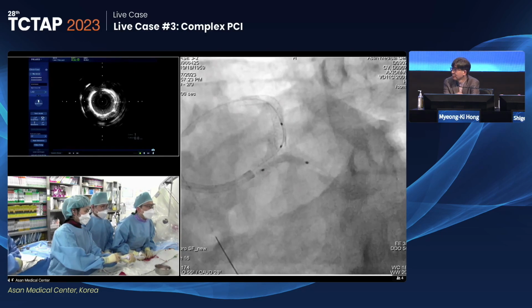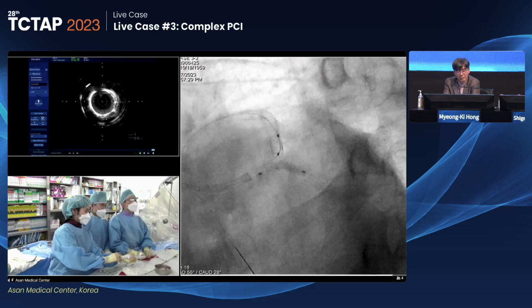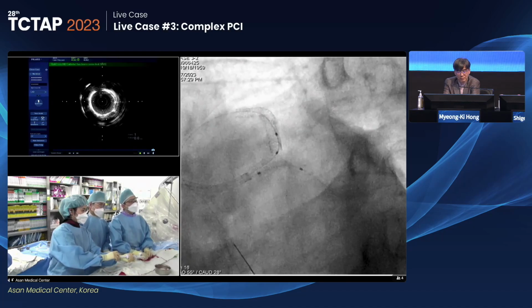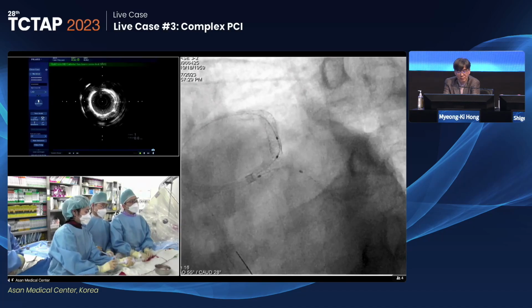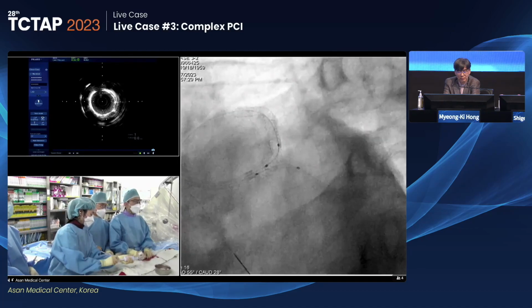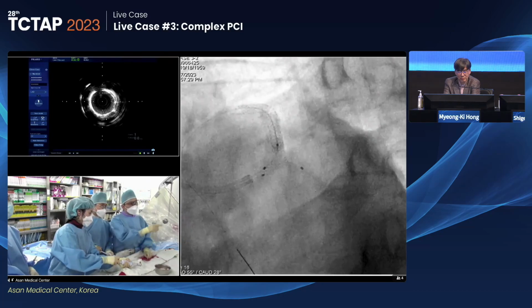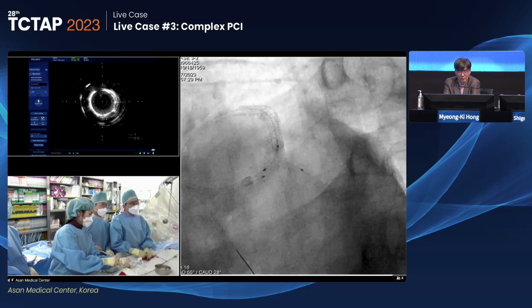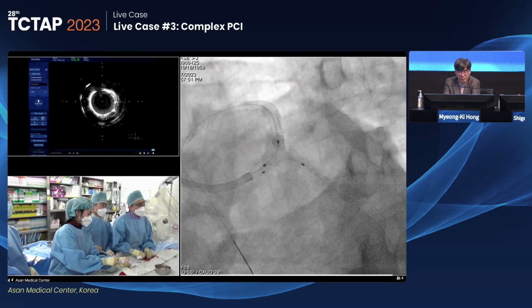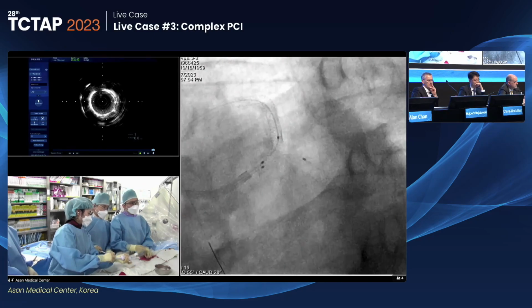It's still not open. This is a small balloon, but it's well opened. Take a time and deflation. And we'll also inflate the 3.0. This is NC, 20. You can see that there's indentation of the balloon. Deflation. Okay, let's do kissing and check the image.